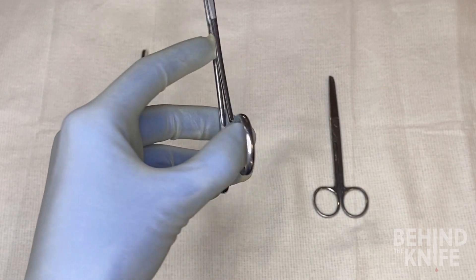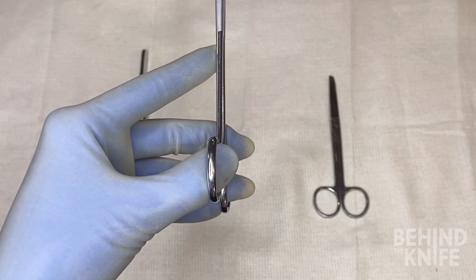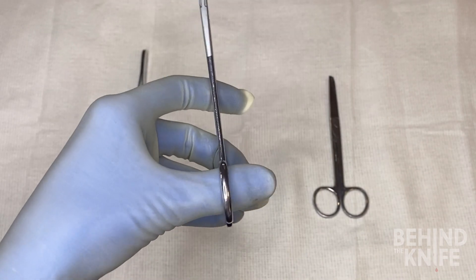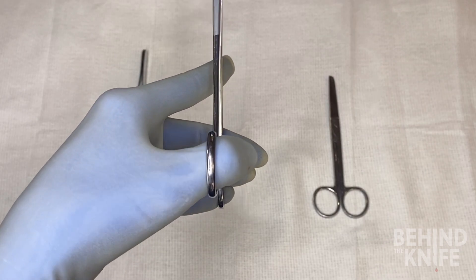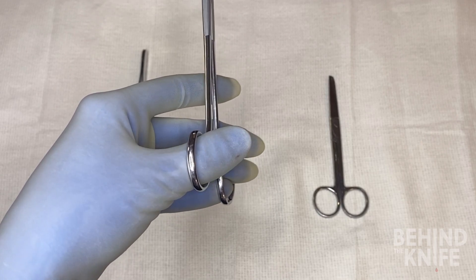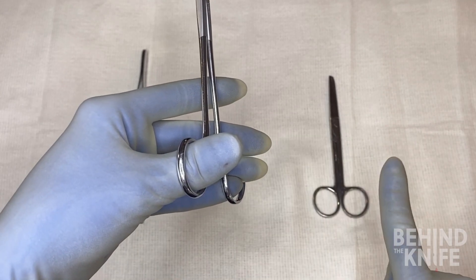Locking instruments can be a bit more challenging with your left hand, as the locking mechanism is designed to be pushed out with your right hand. In this case, what we'll need to do is pull it in with our left hand — specifically, pull in with your thumb to unlock the instrument. This can be very challenging as there's often not much space to do that, so another way to think about it is pushing out with your ring finger.